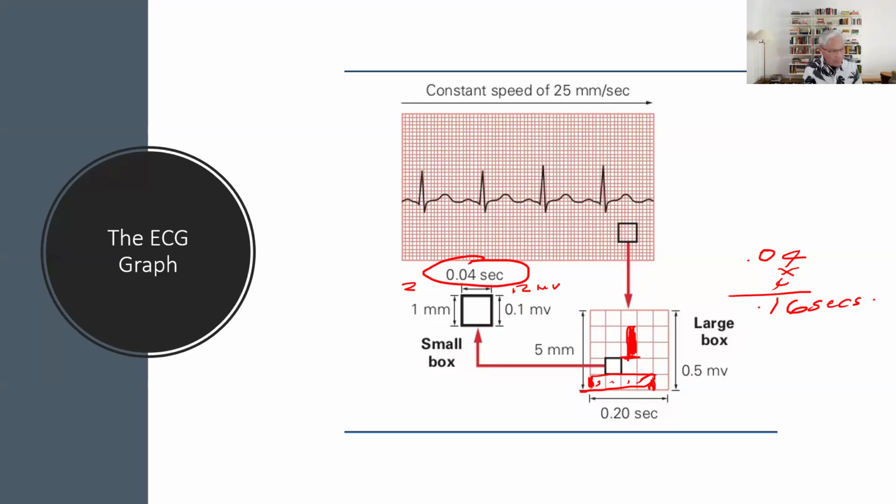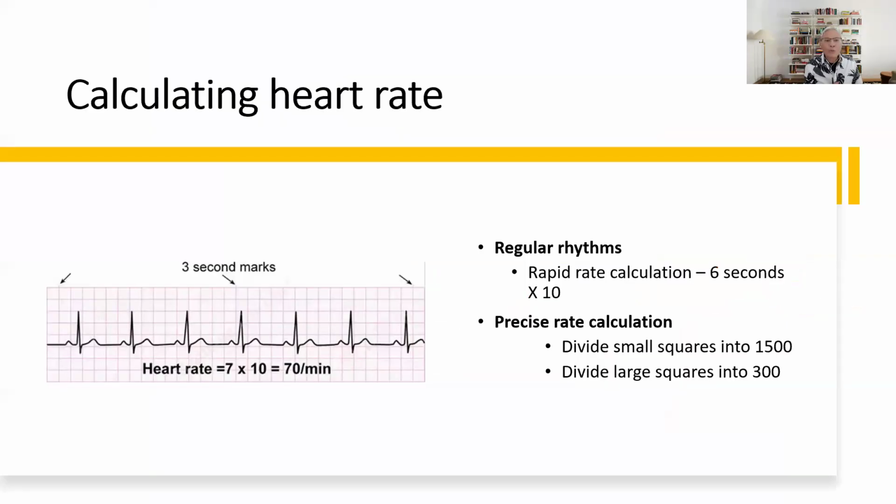Clear? All right. Let's go now to calculating heart rate. There are many ways to calculate rate in an electrocardiogram, but in the NCLEX, you don't have time to do anything other than one method of calculation.